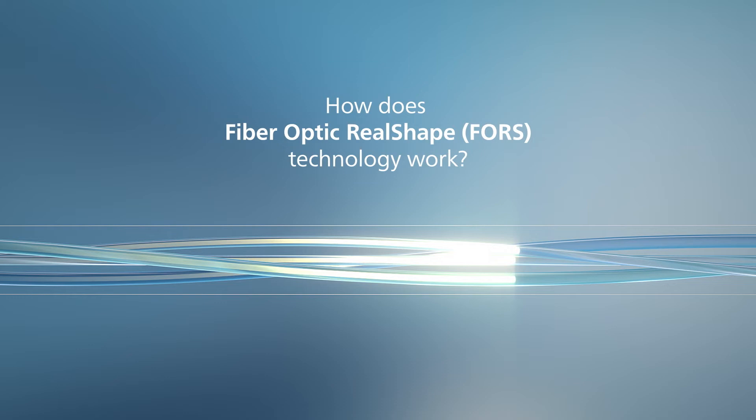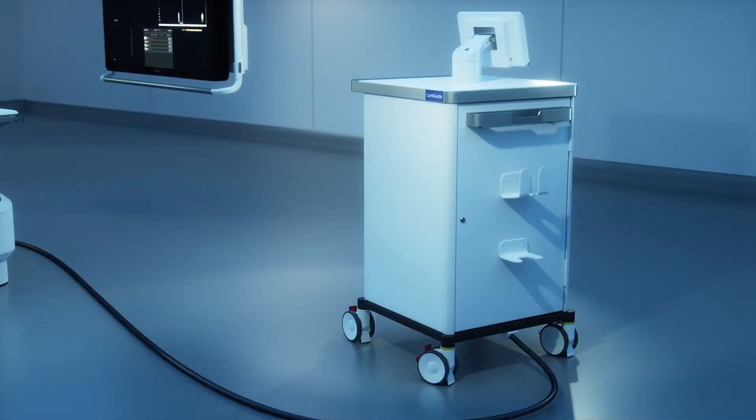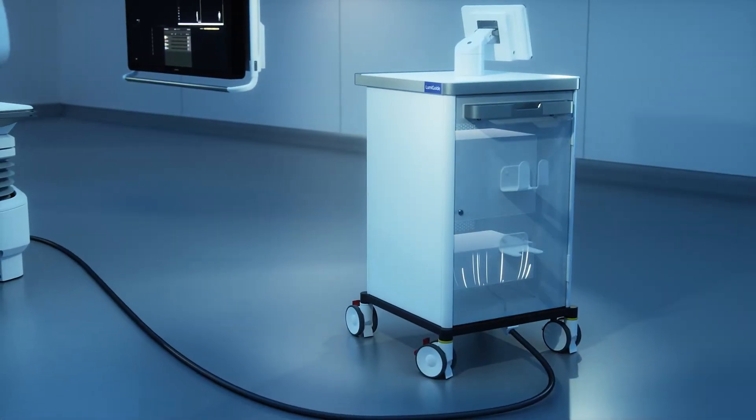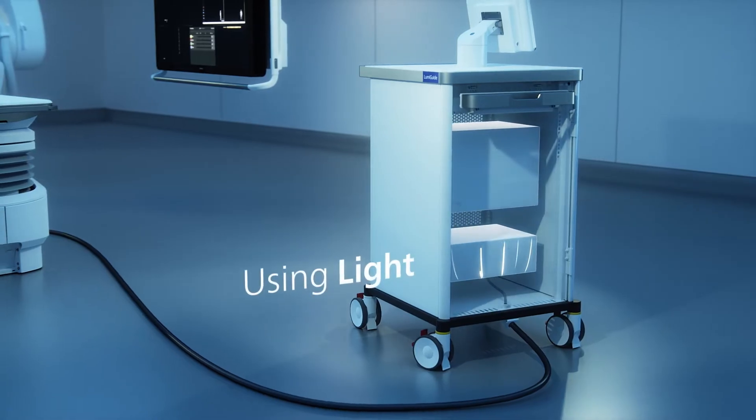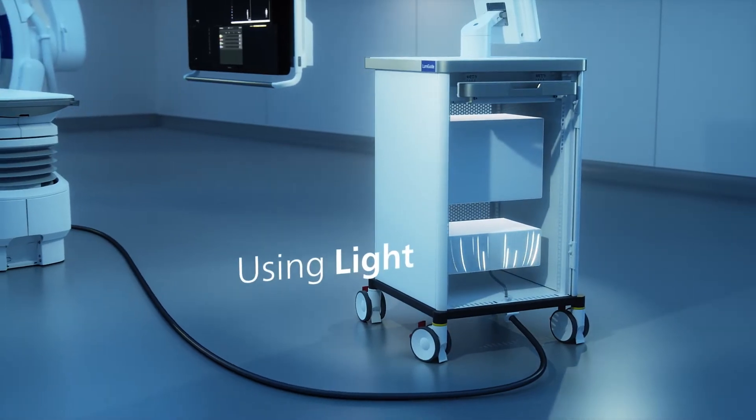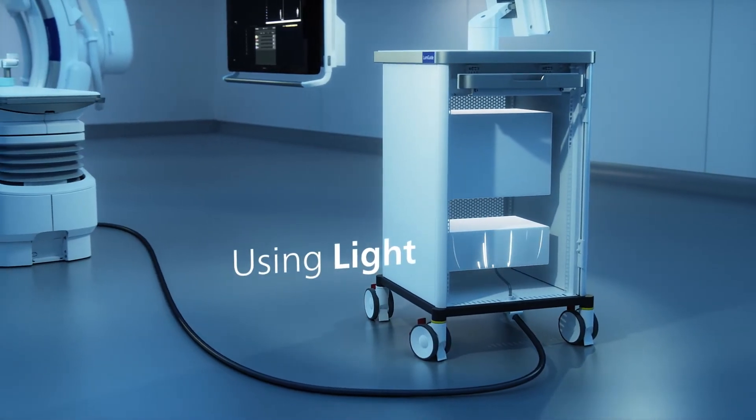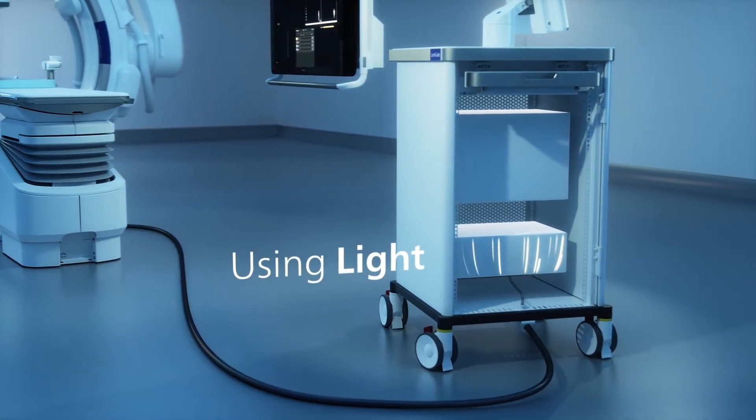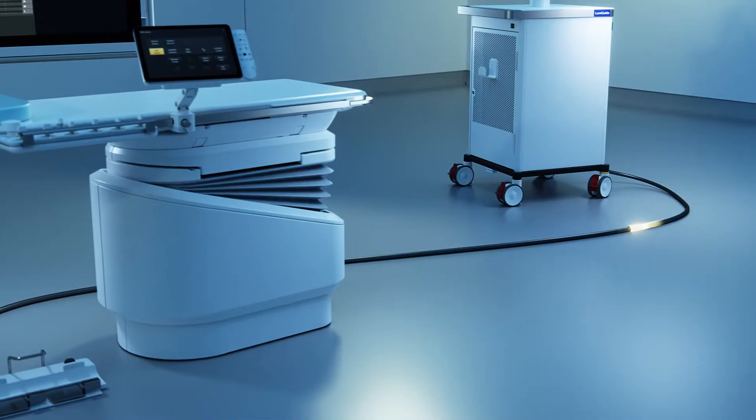Philips Fiber Optic Realshape Technology, also known as FORS, uses light instead of X-ray to visualize devices inside the body.